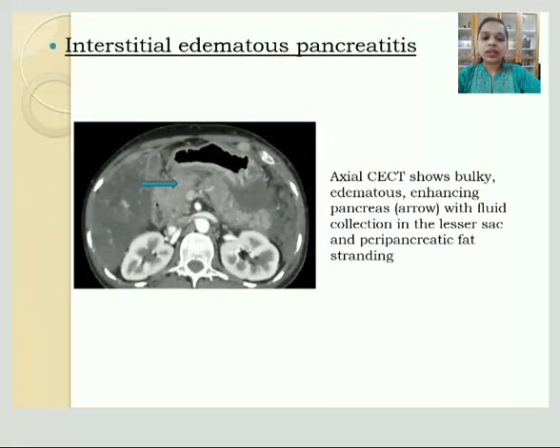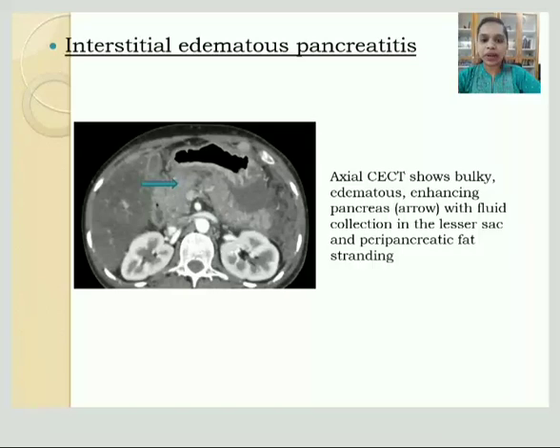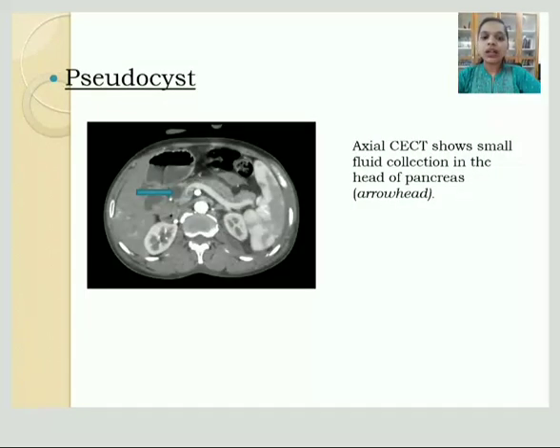Next is an axial CECT image showing a bulky edematous enhancing pancreas, indicated by an arrow, with fluid collection in the lesser sac and peripancreatic fat stranding. And next is an axial CECT image showing a small fluid collection in the head of the pancreas, indicated by an arrow, consistent with a pseudocyst.